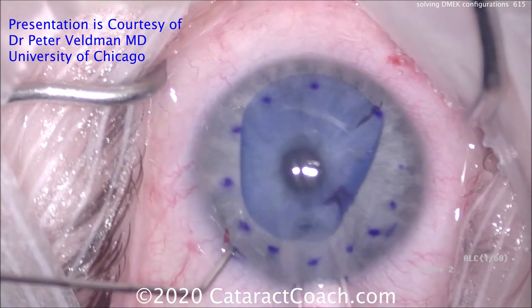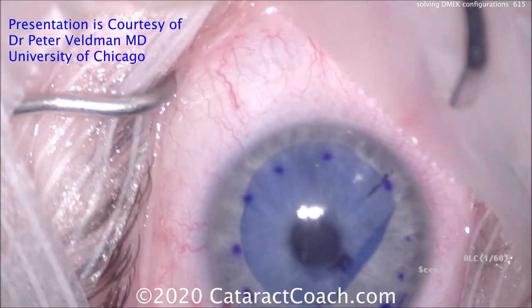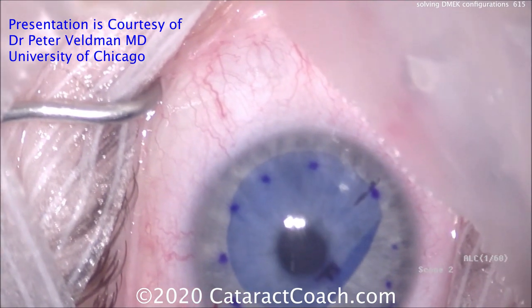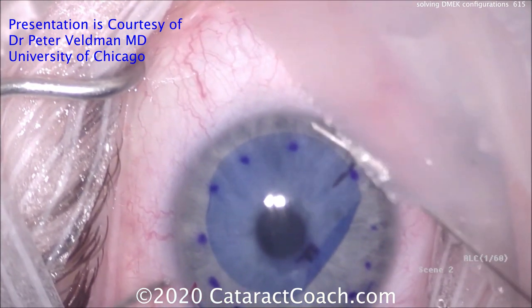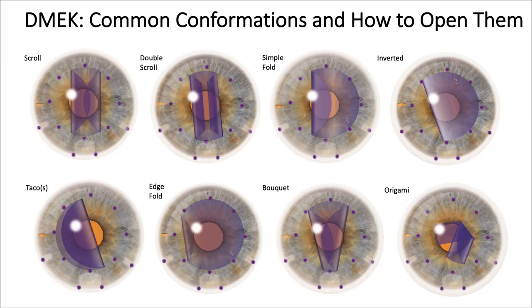It looks like it's pretty well centered. Just a little more deflating of the eye, slowly taking out the tube there, and just a little left to unscroll — tapping here — and wow, that was so easy. I wish it was always that easy in real life.